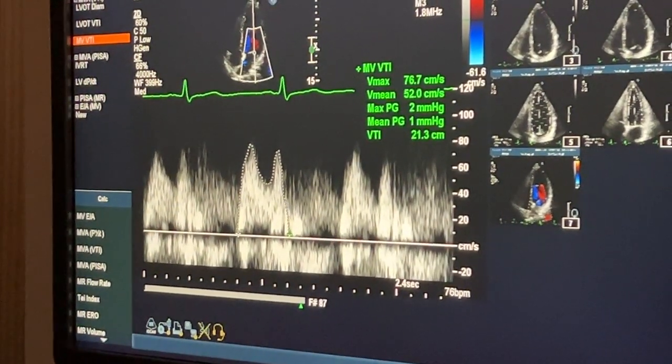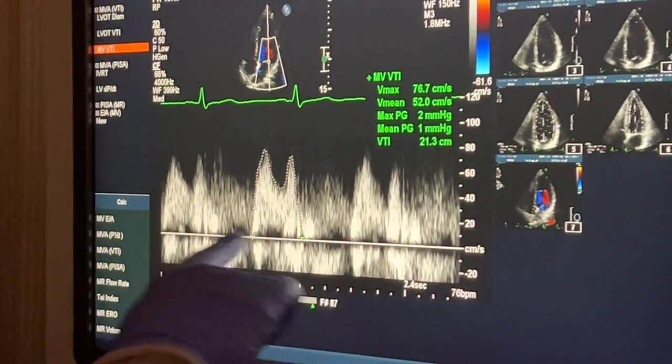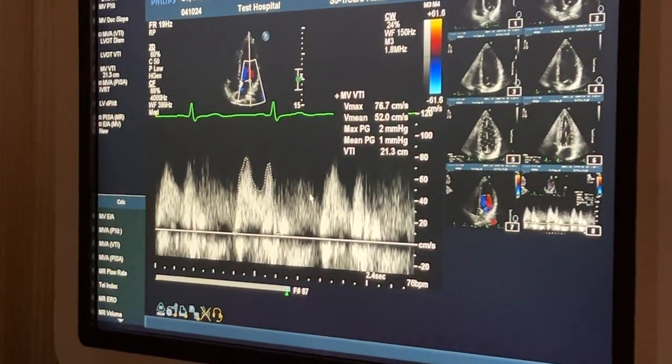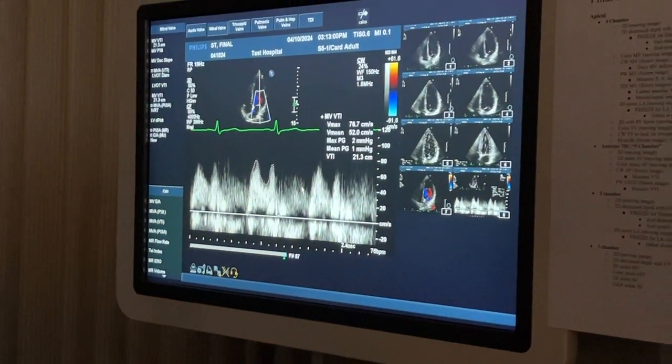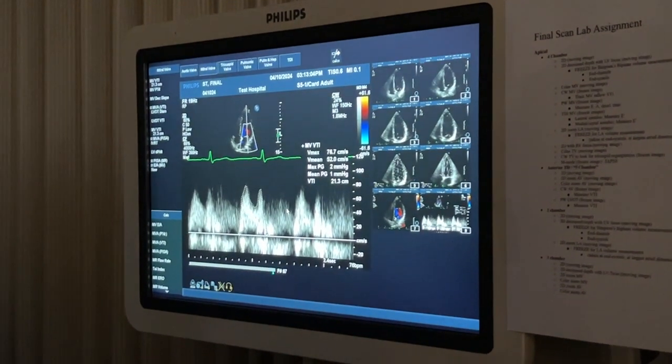And so you can click either the kidney beans. I usually don't click anything once I know I'm at the end of the measurement. All I do is click print, and then it'll save it for me. Because I feel skeptical of these kidney beans. Sometimes they do something weird. Do you know what I mean by that? Yeah, they'll click on something and they give you another calculation.